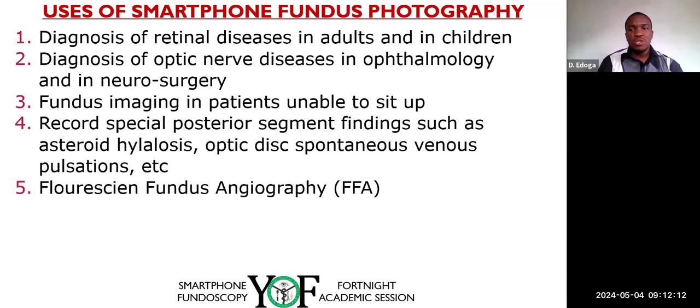Then for patients who are unable to sit up, with the typical fundus camera systems, you have to sit up to be able to put your head in the fundus camera and take it. So if a patient is on the bed and cannot sit up, you need a device that is portable. So it's either you use a portable fundus camera or smartphone fundoscopy will come into place.